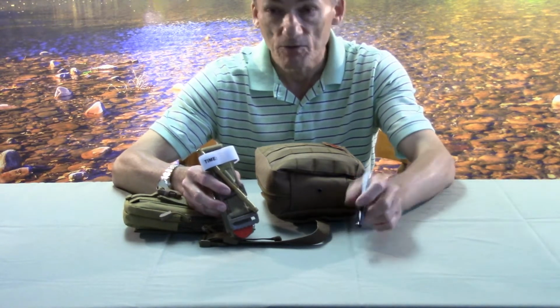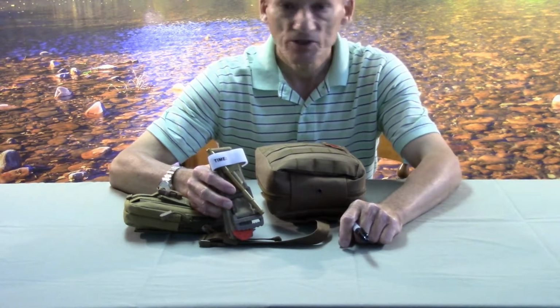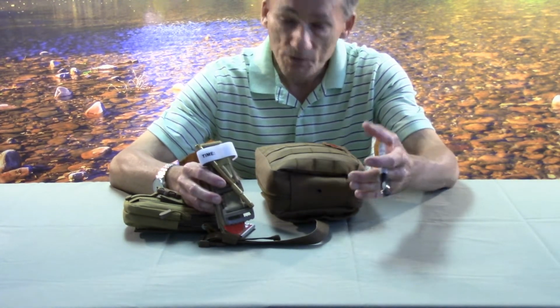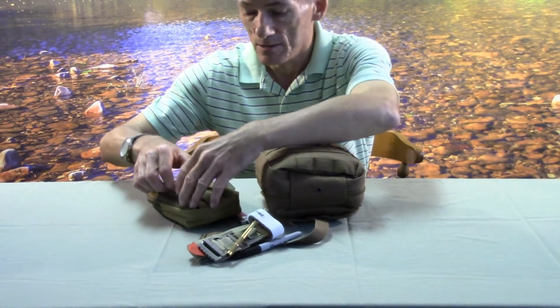Before it reaches a point where they'll probably end up losing the limb. You write the time on there, and that lets the hospital know when it was applied, gives them an idea of what they need to aim for. Anyway, enough on that.